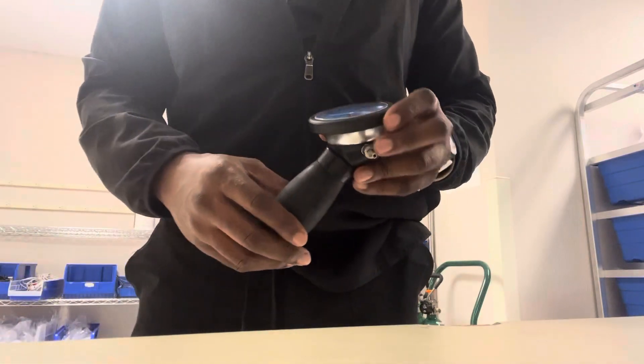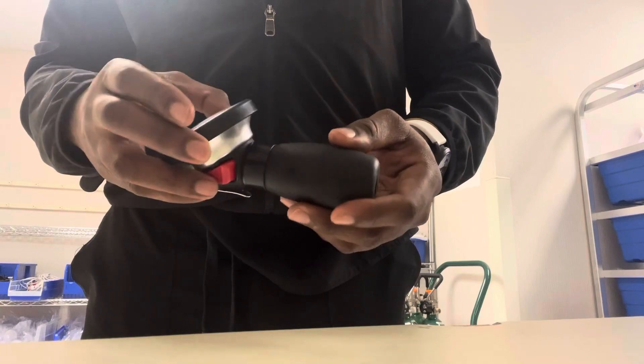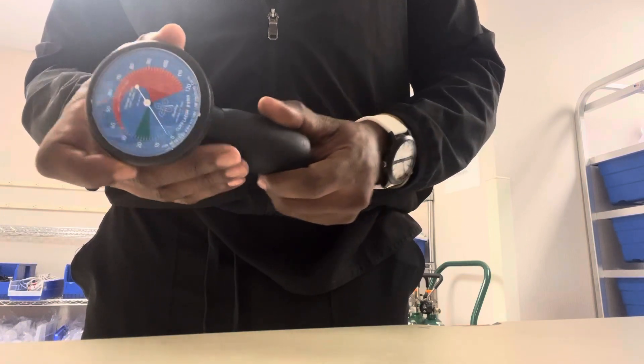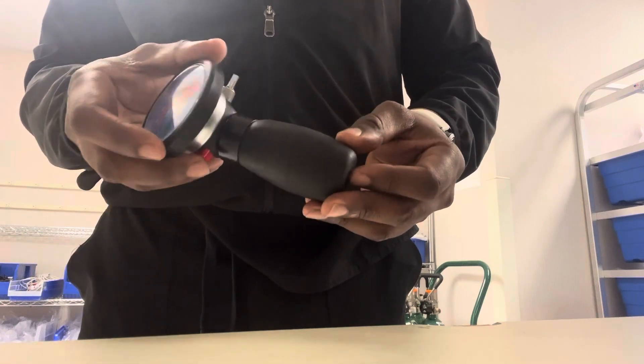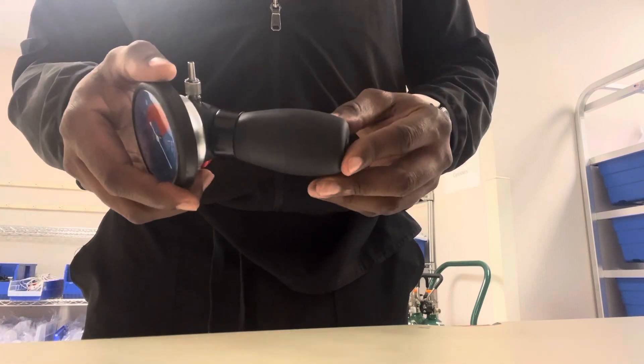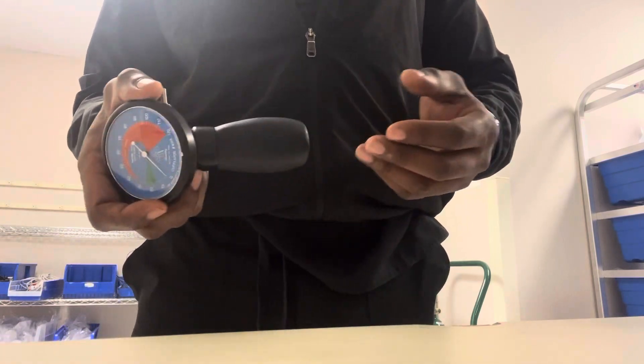Good day, respiratory world. This is our pressure cuff manometer. We have our patient that has an endotracheal tube or tracheostomy tube — an artificial airway in place to facilitate being on mechanical ventilation, being on a trach collar, or being on a number of oxygen devices.